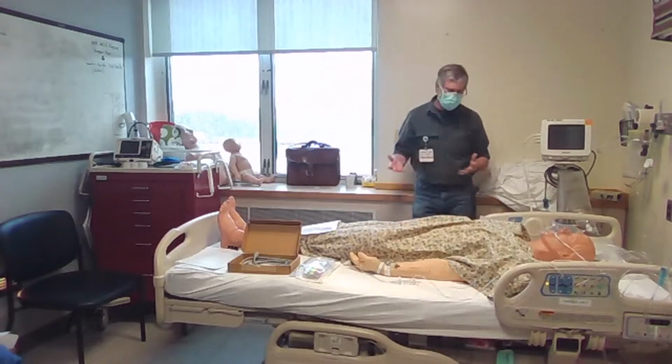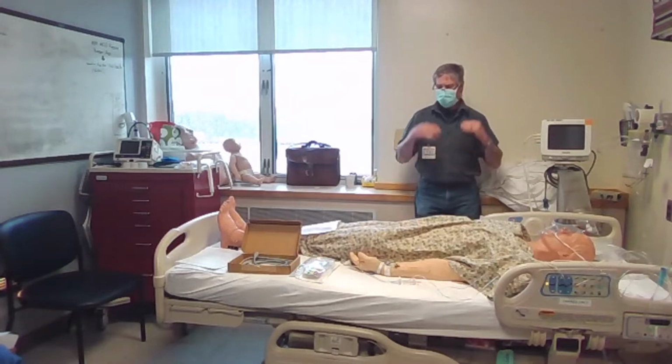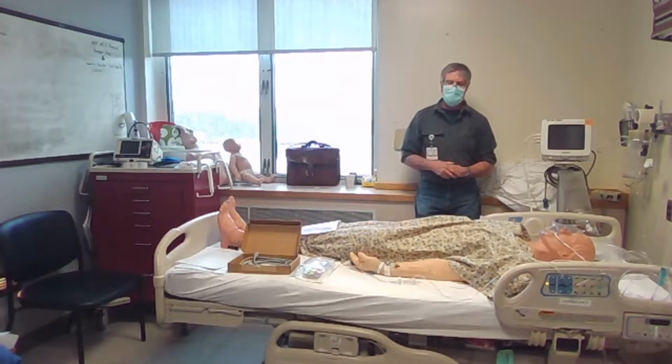Other interesting things that you can get from an A-line, if you've got one in, is you can get an idea about volume management, what a patient's volume status is like. And you can usually track that over time or see variations within it. Are they diagnostic, or are they actually a tool to increase pressure as well?